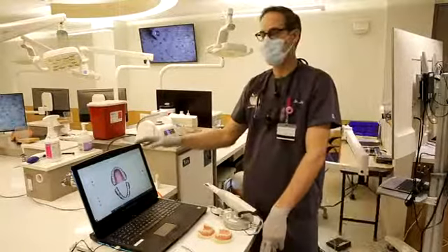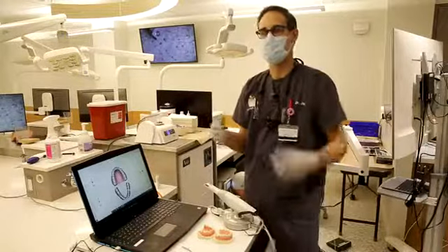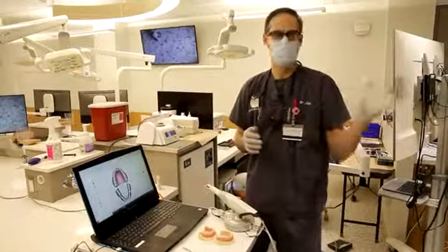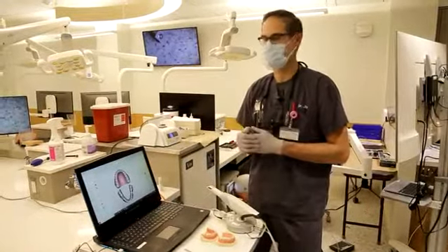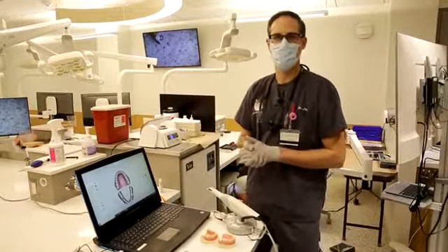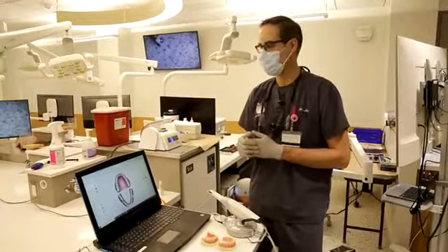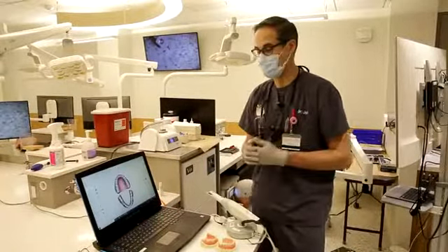We use a model similar to this, the older version, to train our students in the preclinical facility. So we actually have 10 of those available for students. And then we have 5 of these scanners available for our pre-doc and post-doc students. Last year, I think I scanned 15 to 20 single unit crowns and actually 2 bridges with students. We were able to cement them on a patient at the next visit, which was really nice.